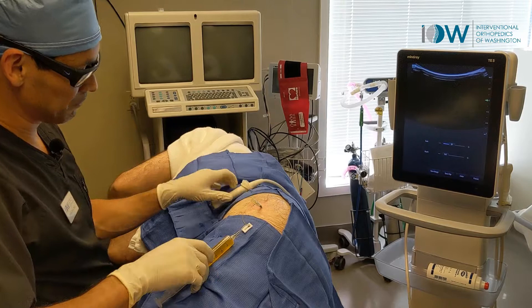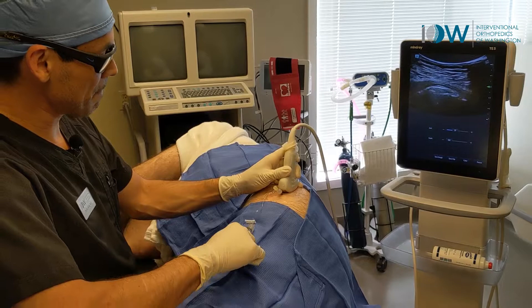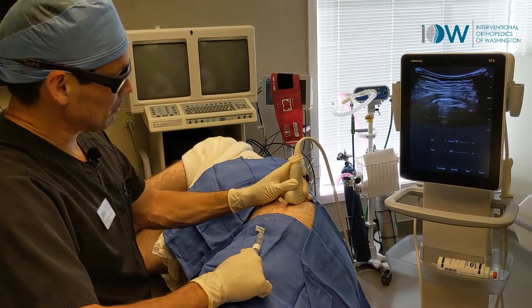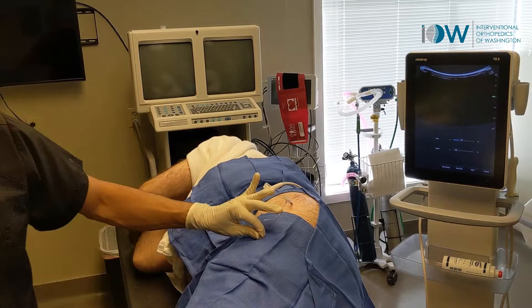This is where we start to take it right back out. I'm using my hand here to just try to keep that fluid in that area and direct it towards the needle again. We've taken some out. We're going to continue with that process a couple different times at a few different locations.